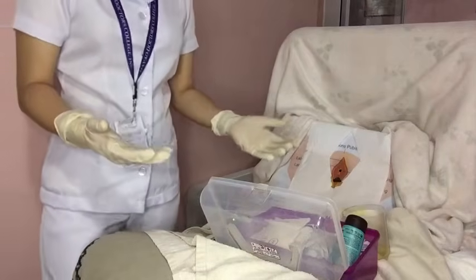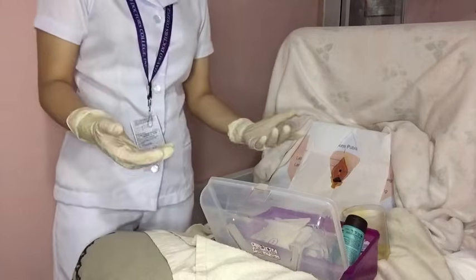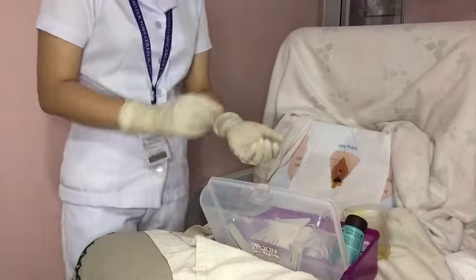Now, after cleaning the genital area, I am going to change my gloves because my gloves are already contaminated.